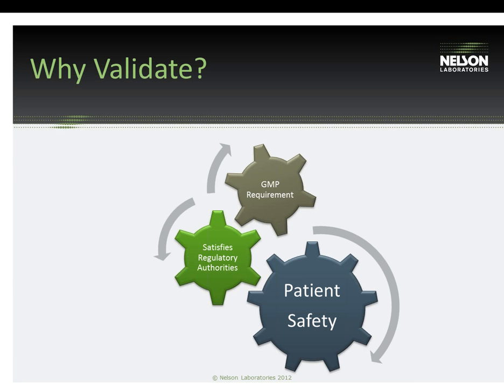Also, with regards to patient safety, the effect to the function of the device should also be examined as part of the cleaning validation. For example, there was a large lawsuit and recall about 10 years ago where there was so much oil remaining on these implants, it was a hip implant, that the oil was acting as a barrier between the implant and the bone, and the patient's bone could not grow and integrate into the implant because there was so much oil residue left behind.